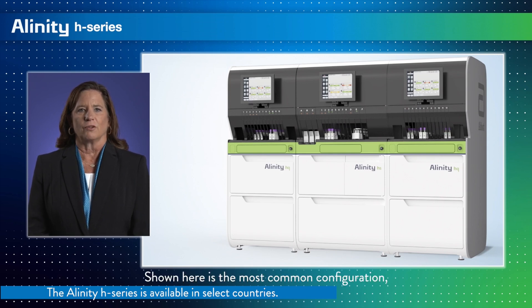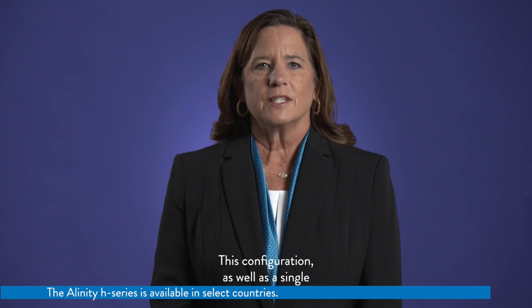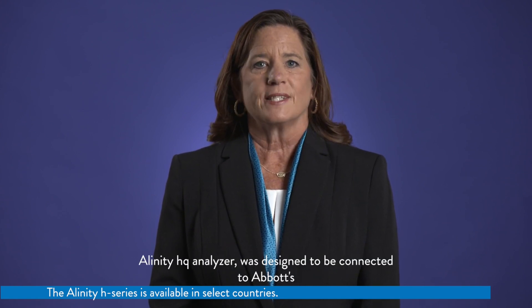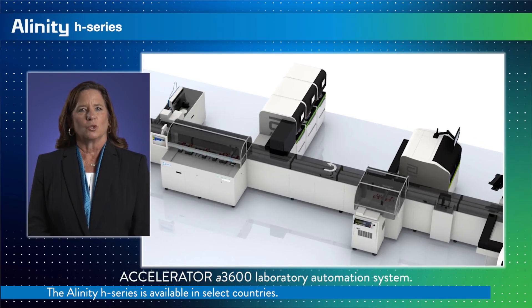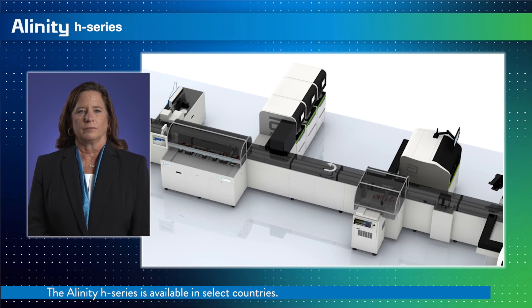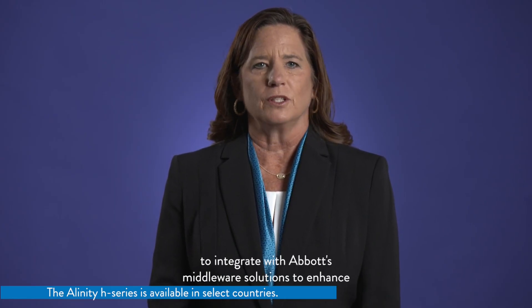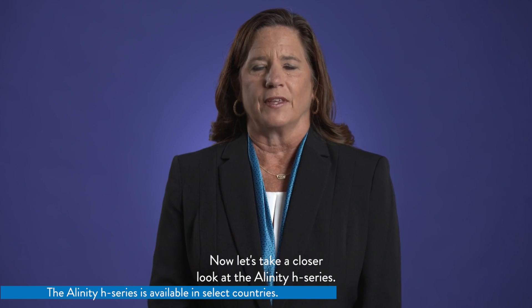Shown here is the most common configuration, which is composed of three modules: two Alinity HQ analyzers with the Alinity HS in the middle. This configuration, as well as a single Alinity HQ analyzer, was designed to be connected to Abbott's Accelerator A3600 laboratory automation system. The Alinity H series is also designed to integrate with Abbott's middleware solutions to enhance a personalized solution for any laboratory.